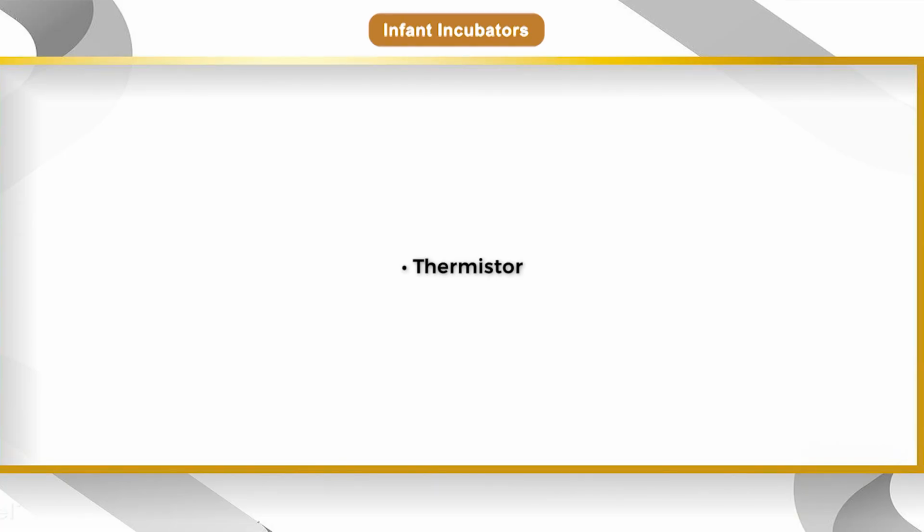Thermistors are used on the chest or abdomen of the infant to measure the skin surface temperature. Proportional control of the circuit of the heating elements is used for these conditions. The thermistor is covered by a thermal insulator or a foam pad and special tape to avoid direct heating from the heat source. It also contains a monitor of transthoracic impedance, and movement of the baby is measured using a displacement detecting pad. Movement of the baby's chest is measured by the chest wall, with an alarm control of 15 to 30 seconds.